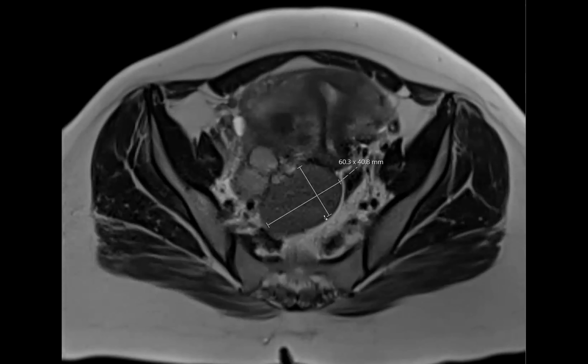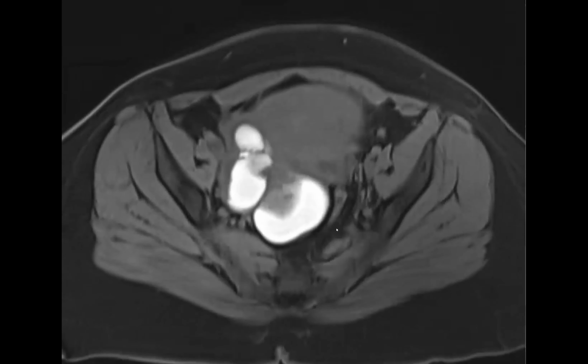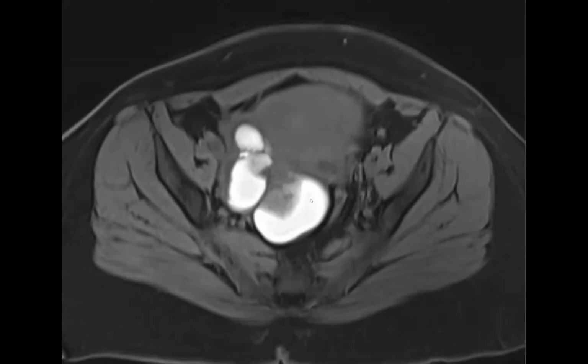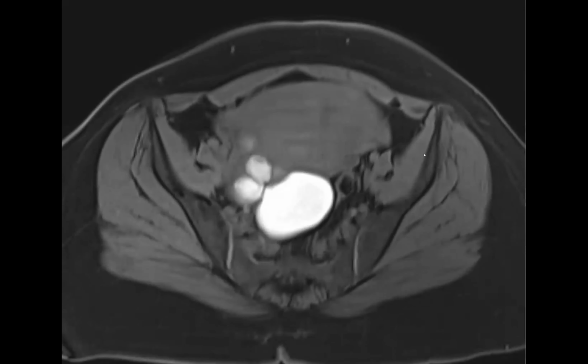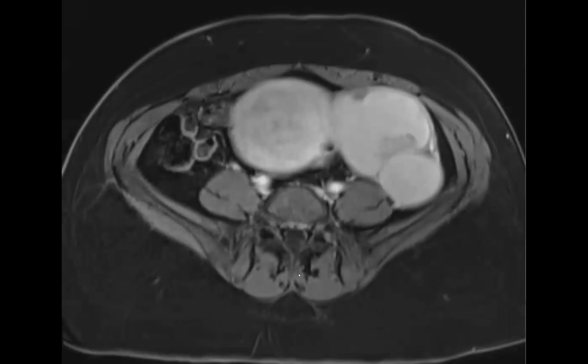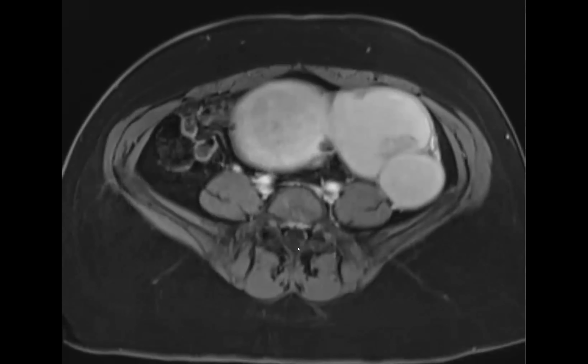So it's like endometrioma. Yeah, exactly. This is a very good look for endometriosis bilaterally. So really T1 bright, multiple, so a multifocal process. On the post-contrast, it looked like this.